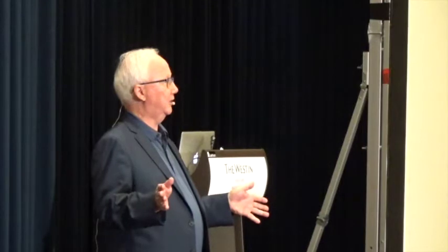Number two, you already have a supply side person, I'm sure, right? Who's your distributor? Patterson. They're going to focus you in one direction only, okay? You may want to look in other directions as well. Not to diss them. What I'm saying is you start there and you hear the pitch, and then you can compare it to other machines.